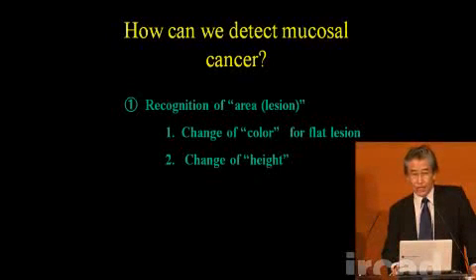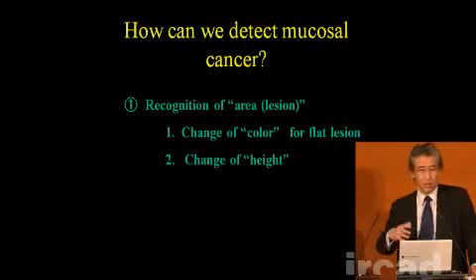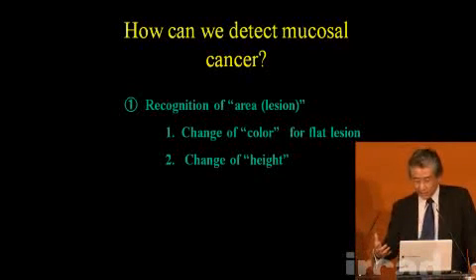So color change for flat lesion. Sometimes redness, sometimes faint, pale, or like that. And the next point is the changes of height on the mucosal surface.